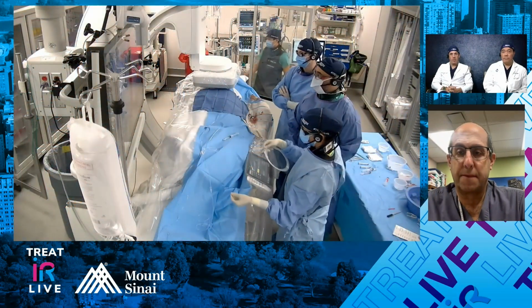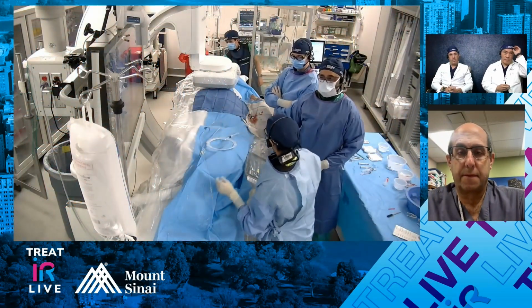I'm sitting here with Dr. Ed Kim, my friend and colleague. I also have on the line a very special guest, Gary Siskin from Albany Med. Guys, good morning. Thanks for the invite to be here. Good to see you. Without further ado, we're going to transfer over to room one. Dr. Patel and Dr. Bishay have a very interesting case for us today.